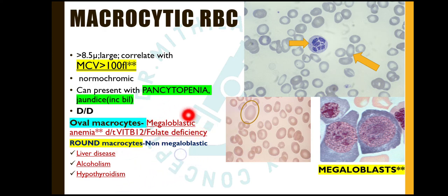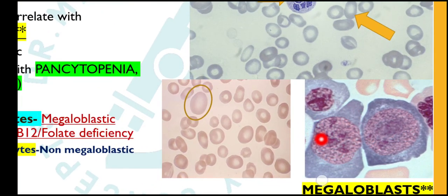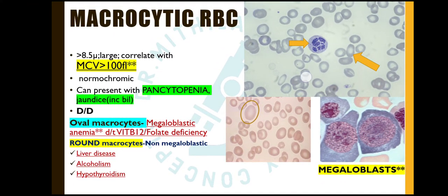To differentiate between megaloblastic and non-megaloblastic causes: in megaloblastic anemia, the bone marrow shows megaloblasts characterized by sieve-like chromatin in the nuclei — this is the characteristic finding of megaloblastic anemia. Additionally, in the peripheral smear we see hypersegmented neutrophils. Normally a neutrophil has three to five lobes; if more than five percent of neutrophils have five lobes, or even a single neutrophil has six lobes, it is called a hypersegmented neutrophil. These are important findings in megaloblastic anemia.